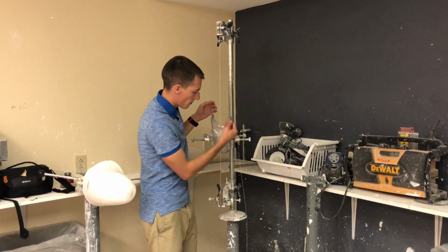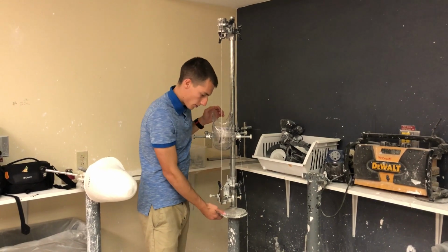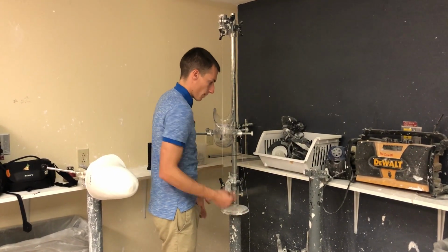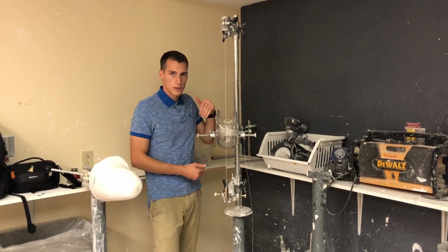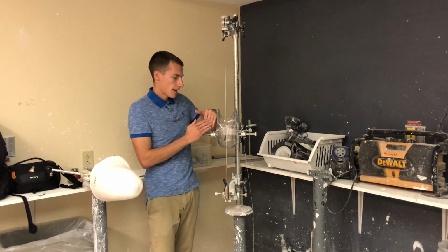So in this case, we have the plumb bob bisecting our check socket over the foot plate. This would allow us to measure how much we inset the foot from our check socket. The plumb bob is also used on the lateral side in order to measure our angle of knee flexion. You'd also have to use a goniometer with that, but yeah.